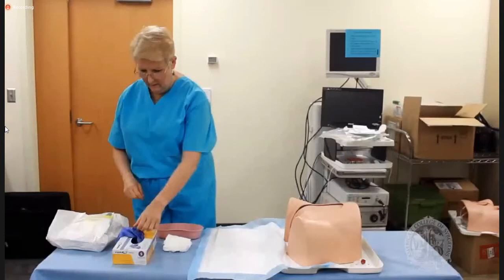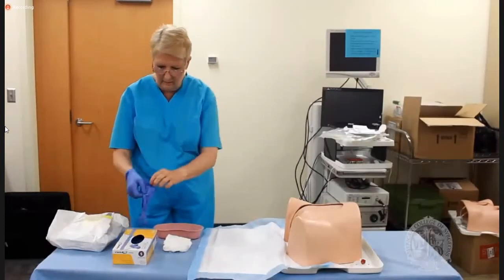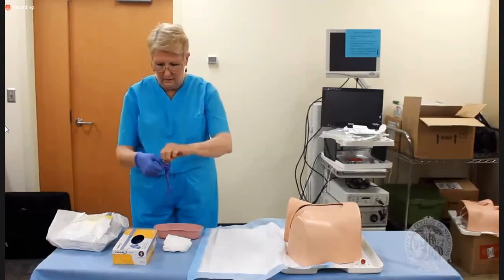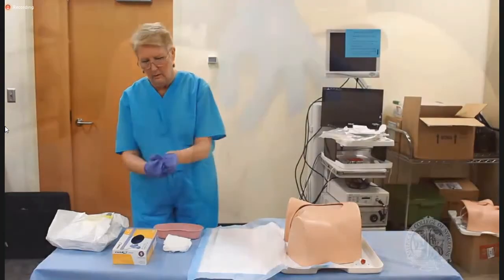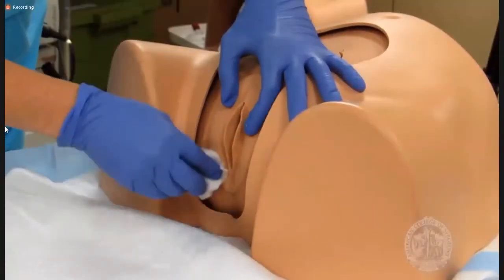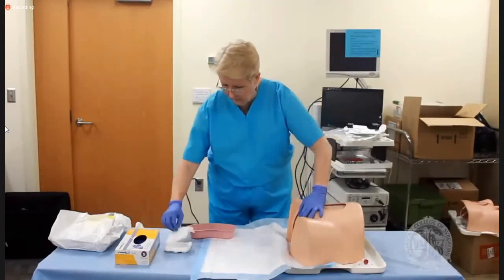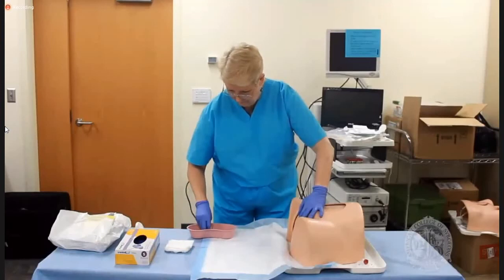In this video, we'll be focusing on placement of a Foley catheter in a patient with a vulva. Positioning is key for this procedure. Place the patient in a supine position with their knees flexed and soles together in a frog leg position. Place a waterproof or absorbent pad under their buttocks and upper legs. Ensure privacy for the patient.